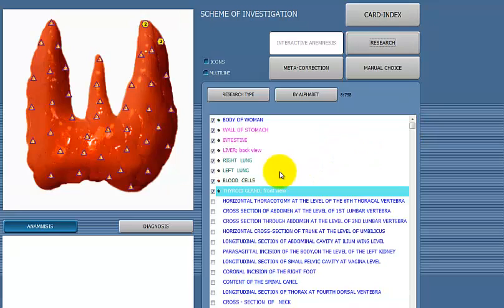Okay, so just a quick reminder that when you are scanning someone, make sure that the headset is on their head, with the left wire, or the part of the headset that has a wire coming out of it, on the left side. If you're not sure, look closely on your headset and it'll say left or right. You cannot scan anyone without the headset being on their head. If you do, then the analysis isn't accurate. So if you want accurate analysis, you've got to make sure that the headset is on their head.